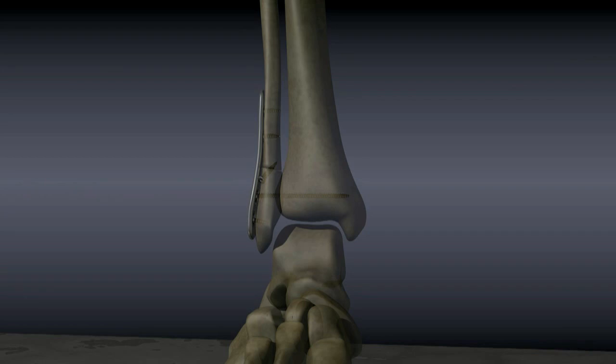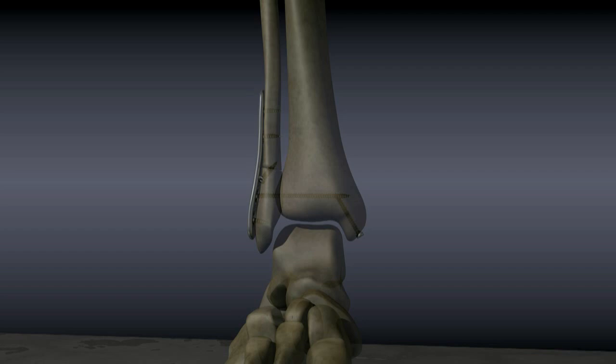If the medial malleolus has also been broken, another screw or wires may be used to fix it back in place. After surgery, a splint or cast may be applied. The hardware usually does not need to be removed. Syndesmotic screws often break after several weeks, but only need to be removed if they cause discomfort.